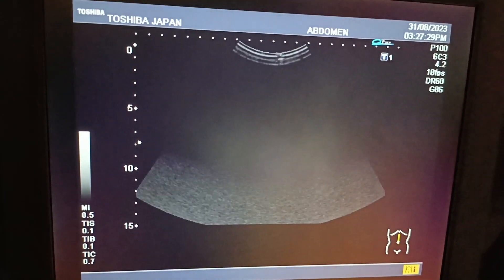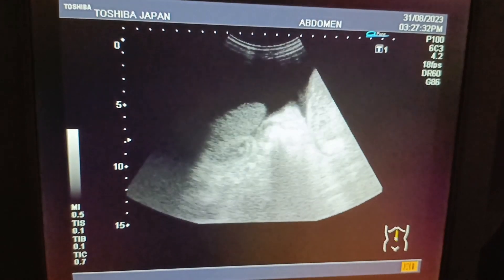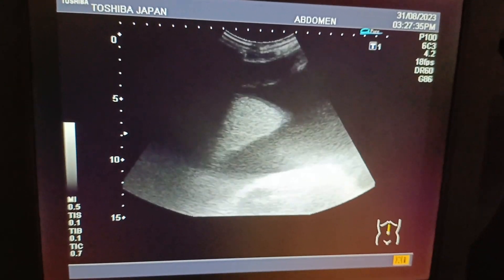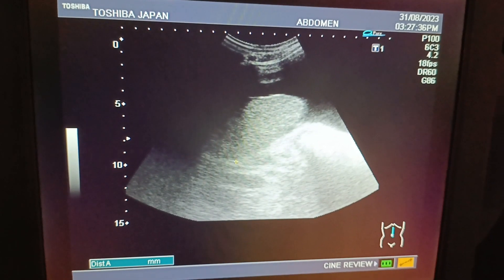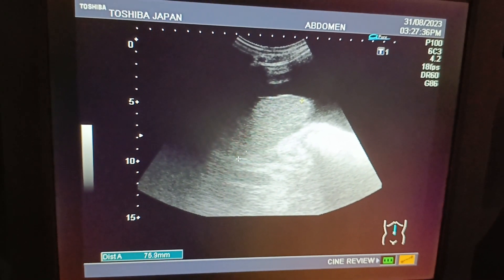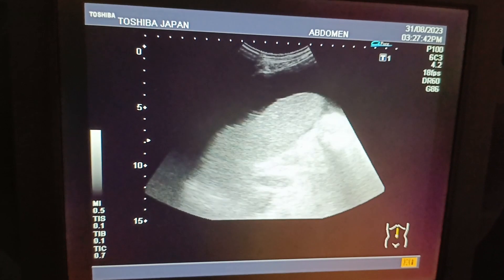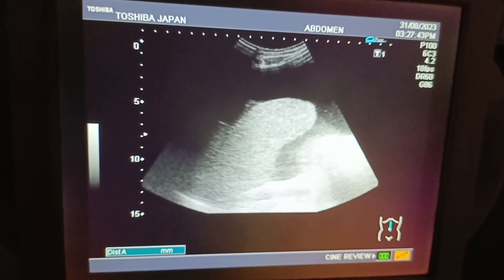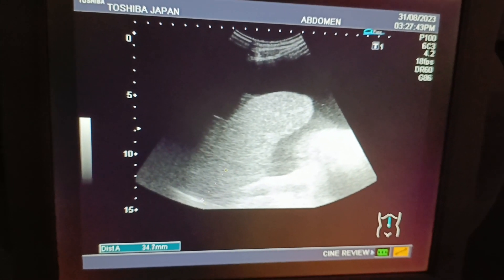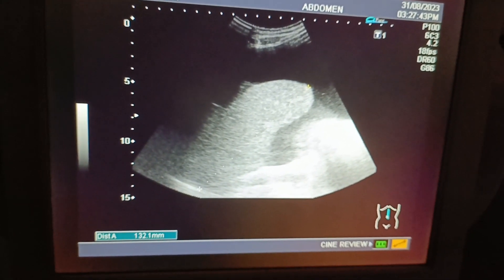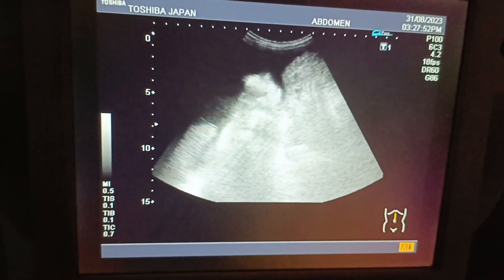This ultrasound is of a 55-year-old female with massive abdominal and pelvic ascites due to a shrunken liver. The liver is in the form of a remnant — coarse, shrunken, and surrounded by ascitic fluid.